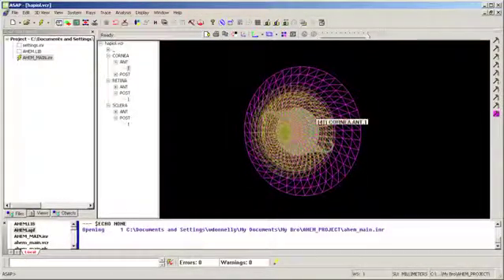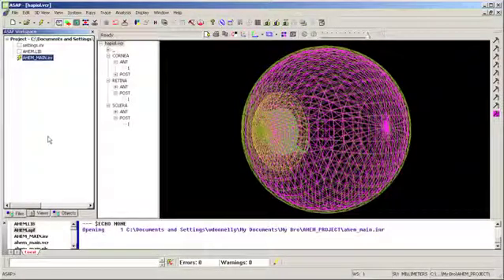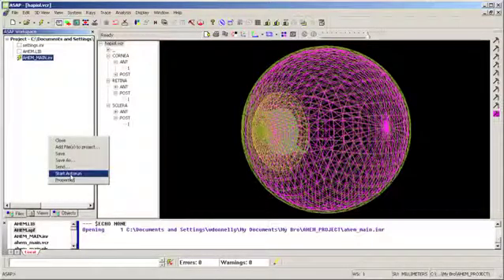So we're going to look at the cornea and see if there's any reflections by passing light into the eye and looking at it from the outside. So this is lid appearance modeling. So I'm going to load my settings file for my intraocular lens.